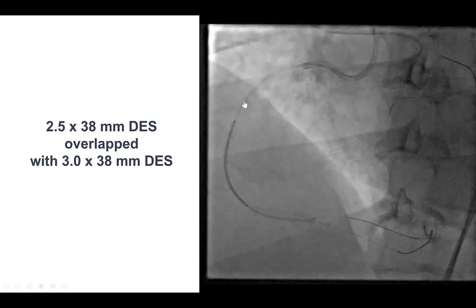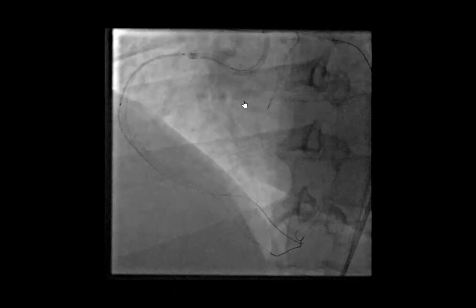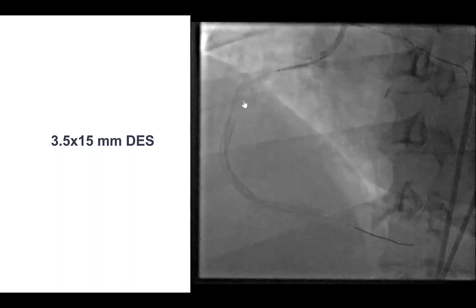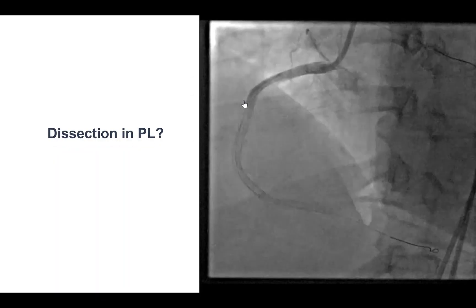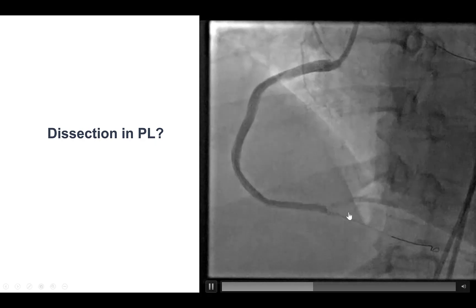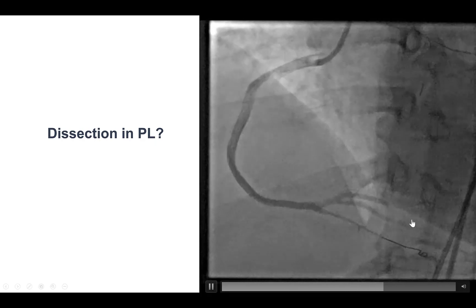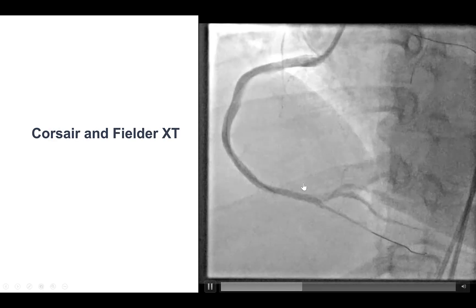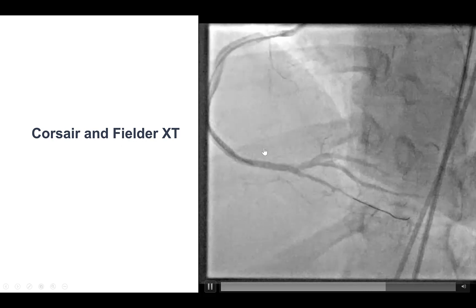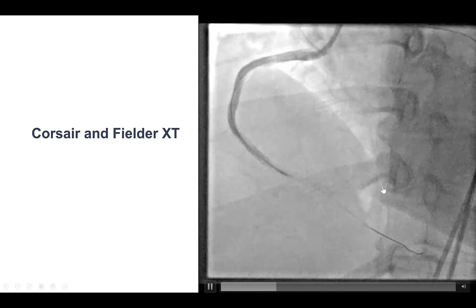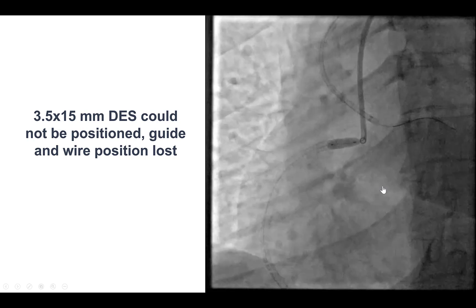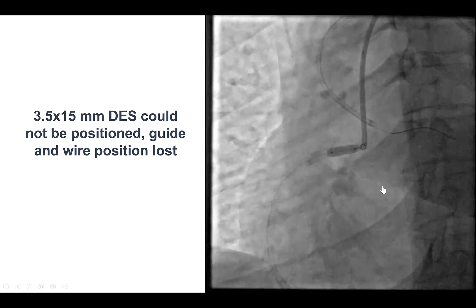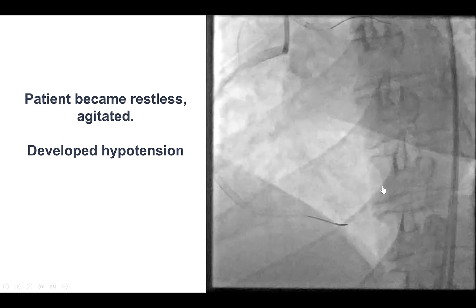The right coronary artery was predilated and then stented with various drug-eluting stents all the way from the distal RCA to the ostium. Unfortunately, it appeared that despite going retrograde, we still had a dissection in the right posterolateral vessel. We delivered another microcatheter into the right posterolateral and performed the STAR technique, which restored flow into the posterolateral. We then placed another stent to cover the proximal right coronary artery.